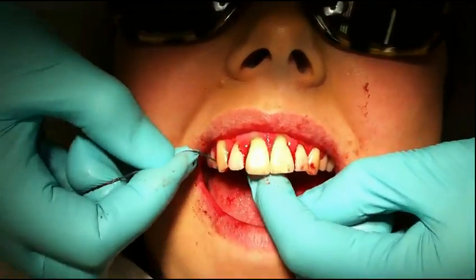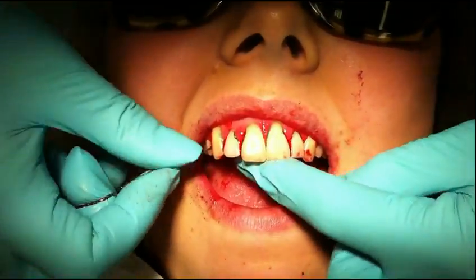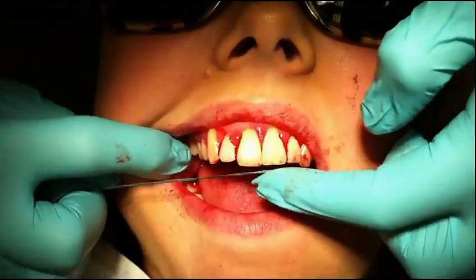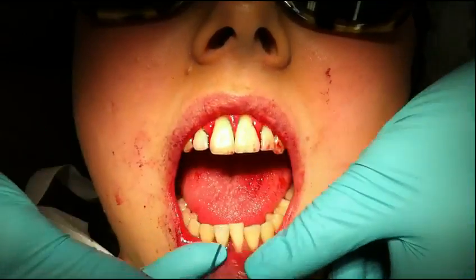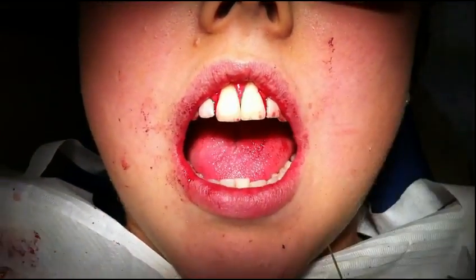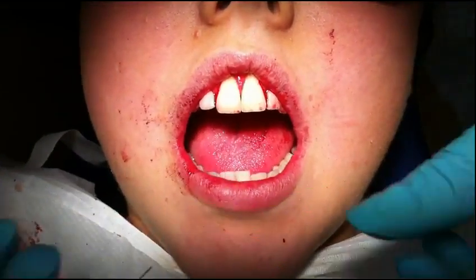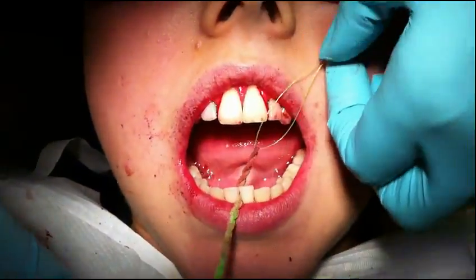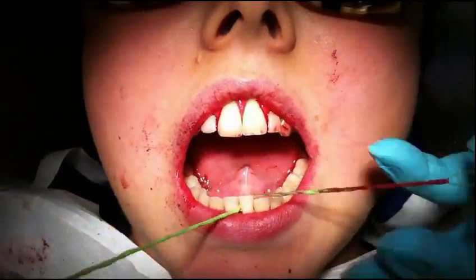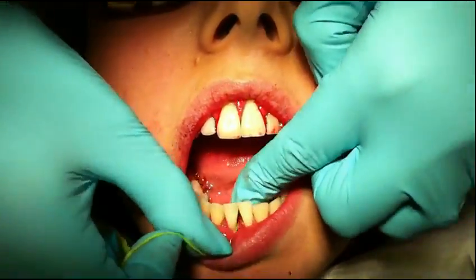With this floss, because it's nice and thin, we can actually go through the contacts as well. But if the contact is very tight, it's easy to use the threader — the threader helps the patient with good access. This is the thicker X-floss; in a situation like this, again the threader is lovely to get through, and then the floss goes up and down.